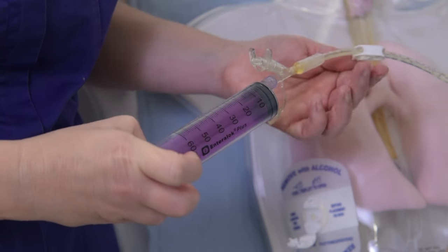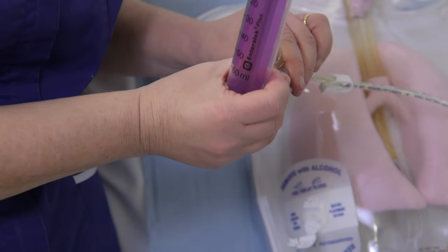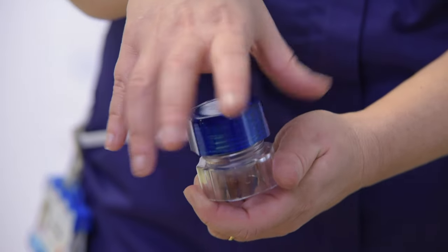Now we will demonstrate how to give a tablet which will need to be crushed. Flush the tube. Unscrew the two pieces of the tablet crusher.